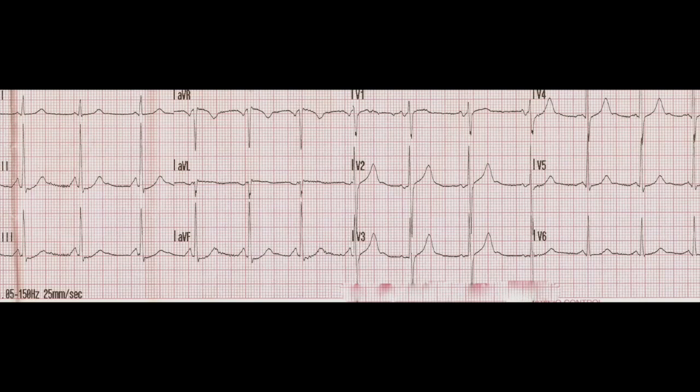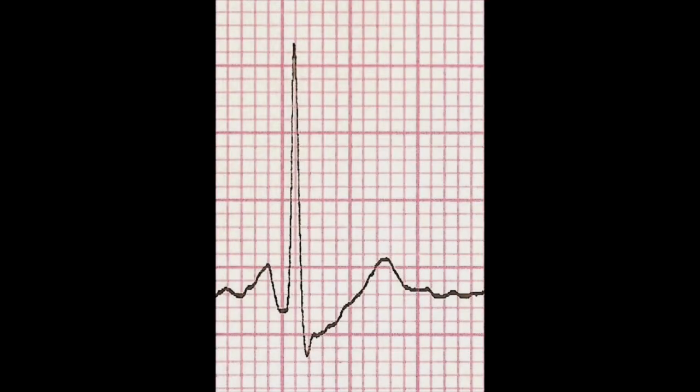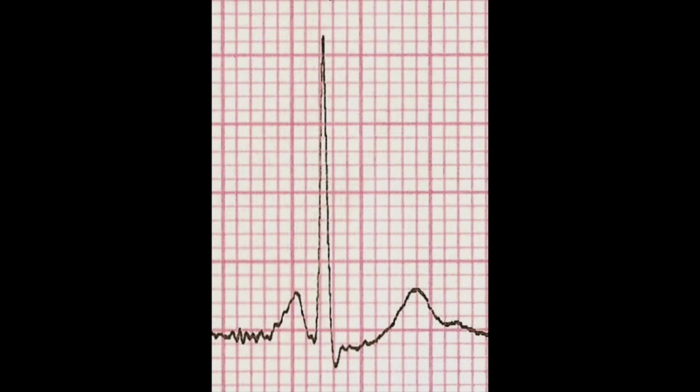That is more complete, so I can say sinus at 80, normal axis, normal intervals, no ST, T-wave changes, or ectopy. Take a closer look at the two EKGs. First, the third beat of lead 2 in the print view does look like there's inferior ST depression. Now look at the second beat in lead 2 from the 12 lead. That depression's gone, or at least much less concerning. Do you see the difference? What caused the difference? Did the patient get better?